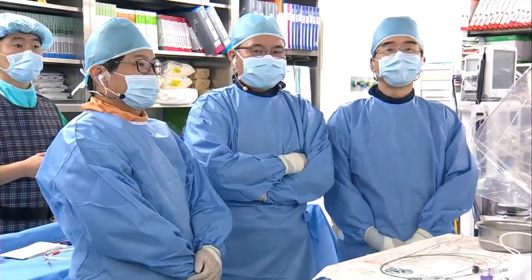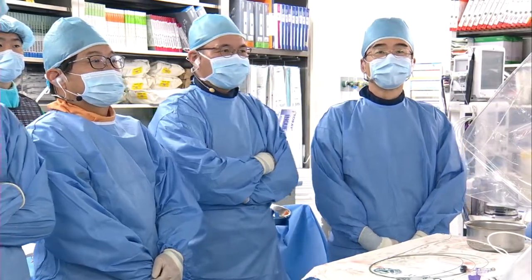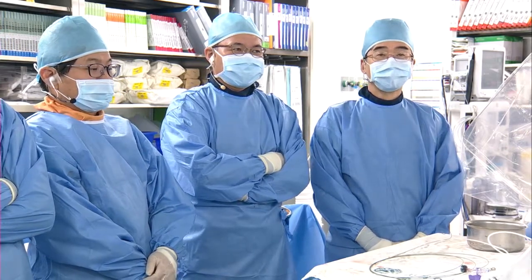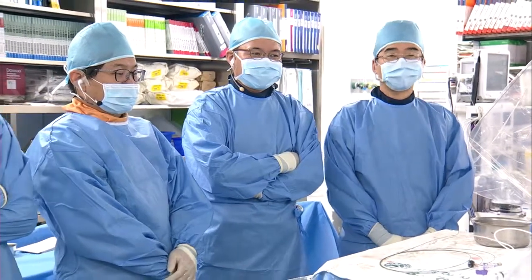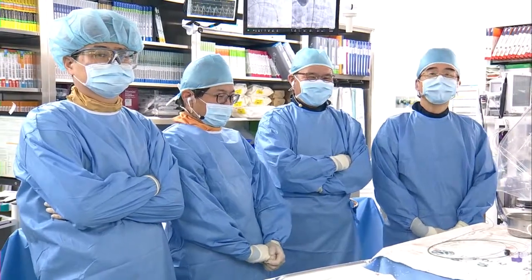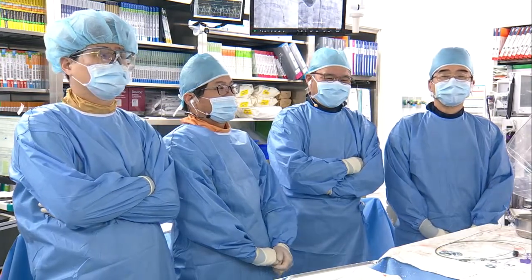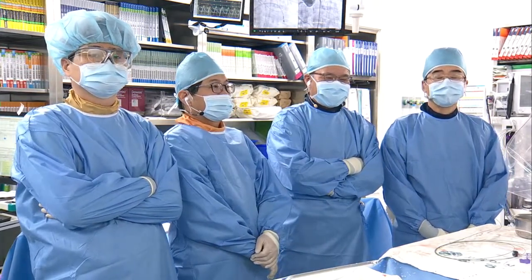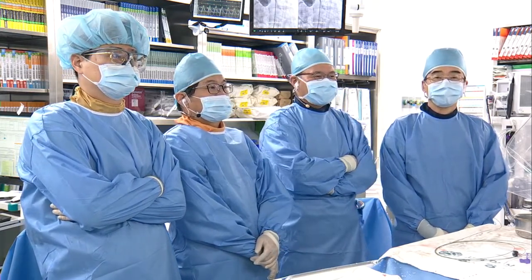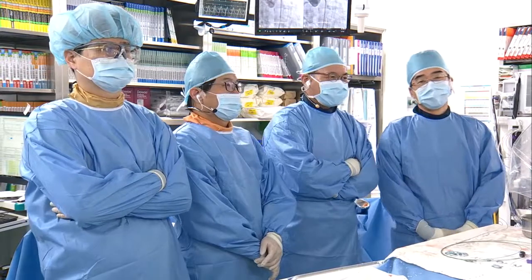Dr. Hong, good morning. Can you hear me? Yes, of course. So thank you for joining us. You may hear that in our first cases from Asan Medical Center. We're going to show some minimal contrast type of procedures. You were just reading about the zero contrast procedures by TEE. However, it's a very important role for the patient group who had relatively renal compromised patients. So I really thank you for reading the concept. Would you introduce the cases and the faculties for that?